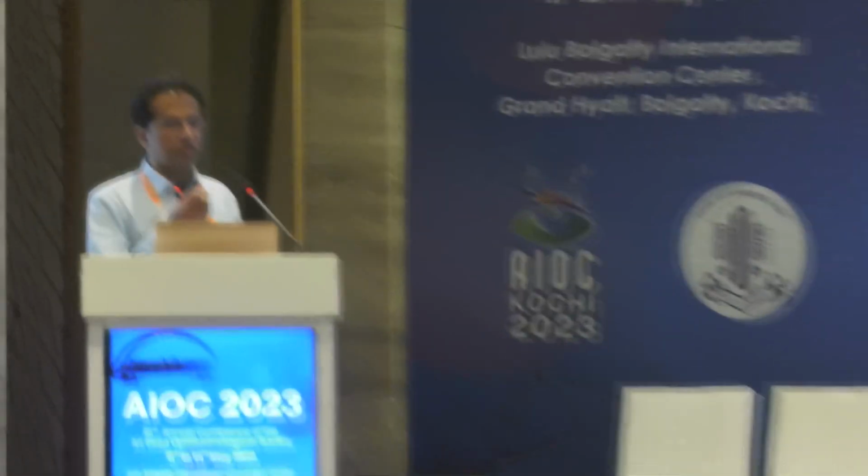How much to dilute? I think the two or three main concerns are, one of the common concerns is the incidence of steroid-induced glaucoma. We have been using this for many years now, and that really has not been a botheration for us. The recommendation is anywhere between 1/4 to 1/10, so one part triamcinolone to 4 parts BSS, or 10 parts BSS. If it is too diluted, you can't really see well. But in our experience, we haven't found anything contraindicating its use, like a raised pressure which is not manageable.